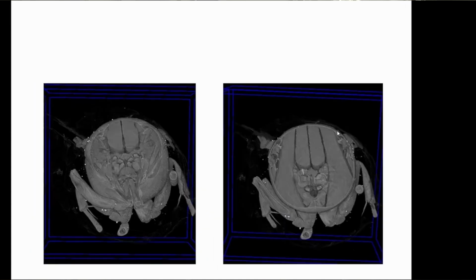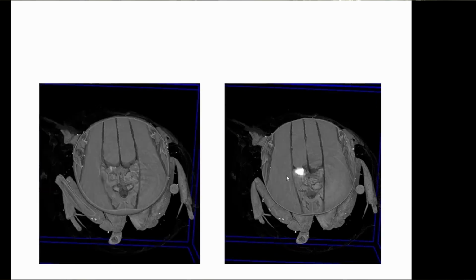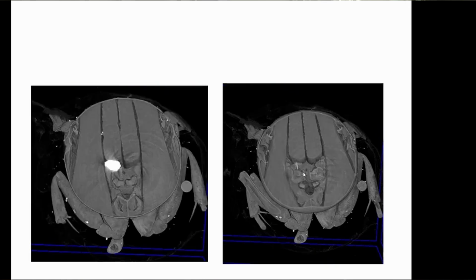We're seeing the large indirect flight muscles, and we're beginning now to see this structure, which becomes even more impressive. Now, nothing that size could have got there intact, so this, as I'm suggesting, is material that has solidified.